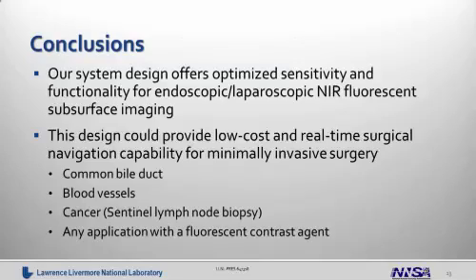And it can be used in a variety of cases, such as for cancer detection, cancer removal, visualizing the bile duct as shown in this particular case example in this presentation, and also preserving other types of important structures, such as nerves, vessels, etc. In general, it can be used with any fluorescent contrast agent that provides targeting localization in specific tissue structures.